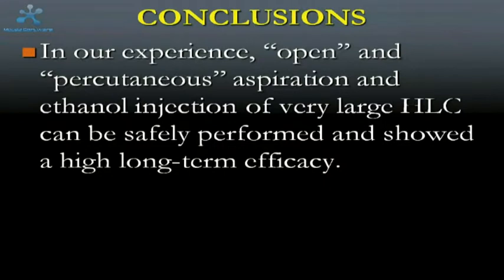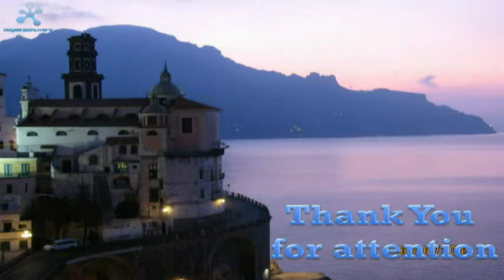In conclusion, in our experience open and percutaneous aspiration and ethanol injection of very large hydatid liver cysts can be safely performed and show a high long-term efficacy. Thank you.